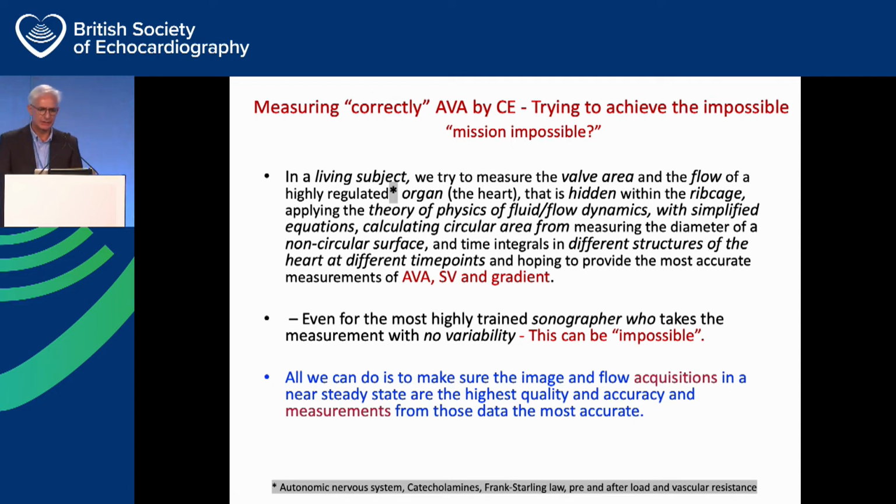And why I thought that this question may be relevant to us, I put it in one long sentence. If you just focus on the highlighted words there, I'm going to read this out for you for 2 seconds here. So can we measure the aortic valve area correctly by continuity equations?